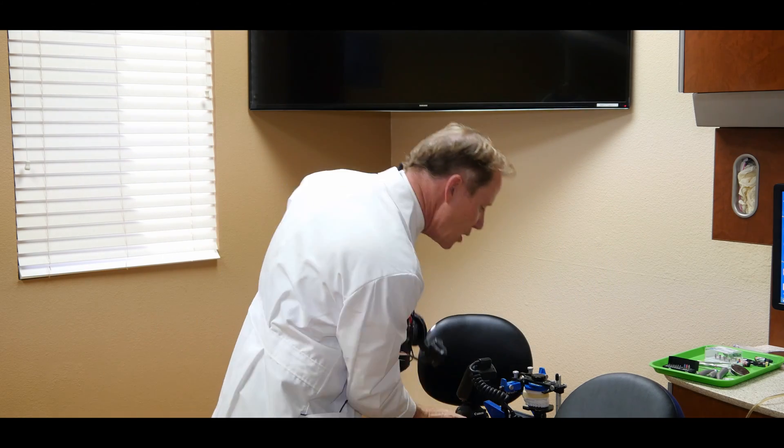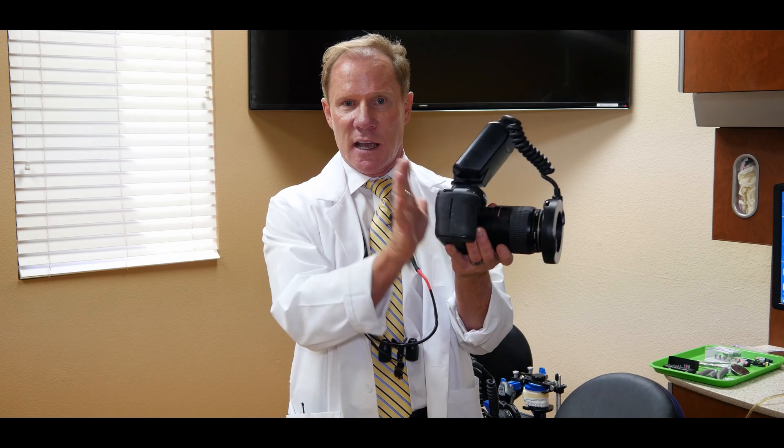So we're going to talk about the ring flash. What I'm going to discuss today is what I call the major line items — the things we want to check and set up before we even sit down with our patient.